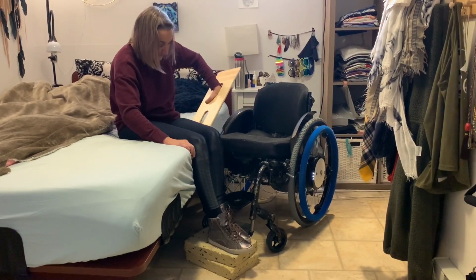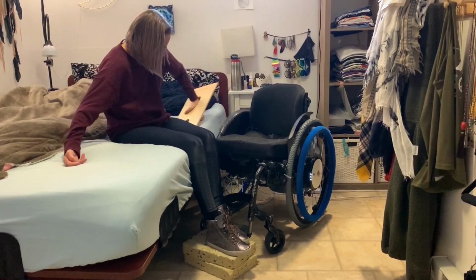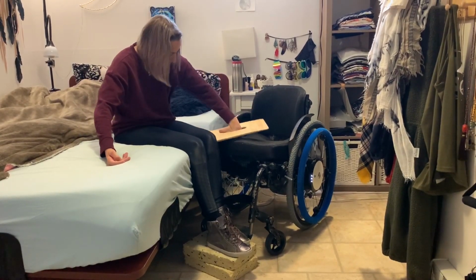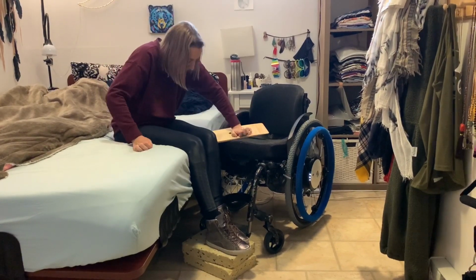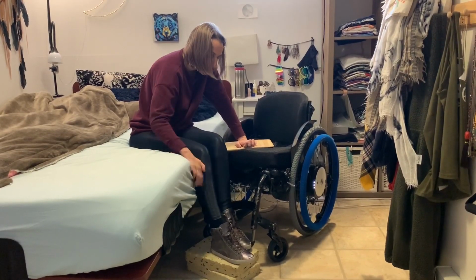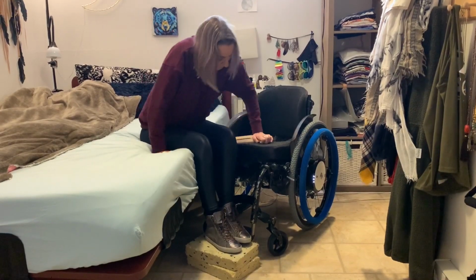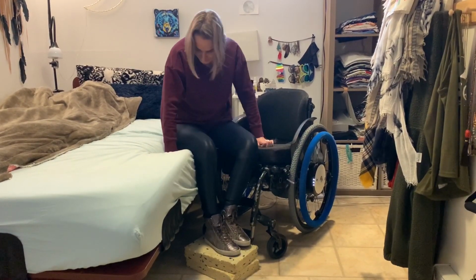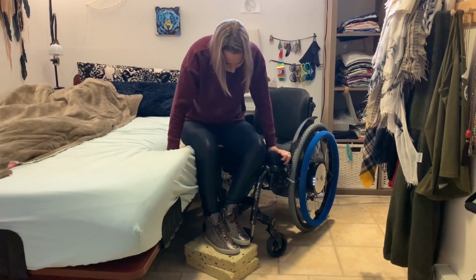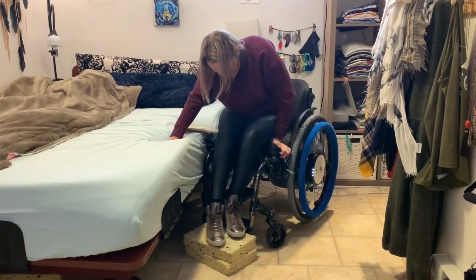I haven't done this with a board in a long time. I'm gonna bring my foot up more onto the foot plate, make it easier. And again, pushing with this arm and pulling with this arm, and then shifting, bringing my weight forward to shift my weight off my bum, and then shifting to the side.